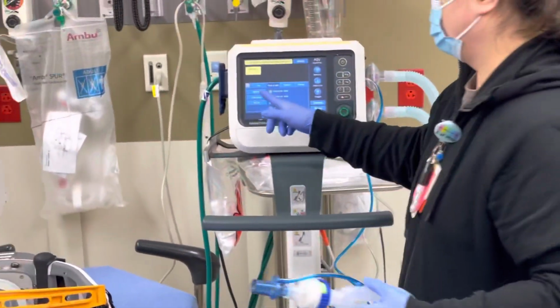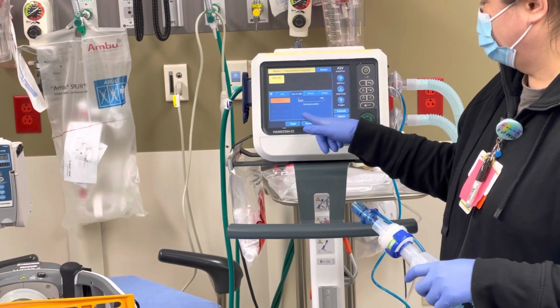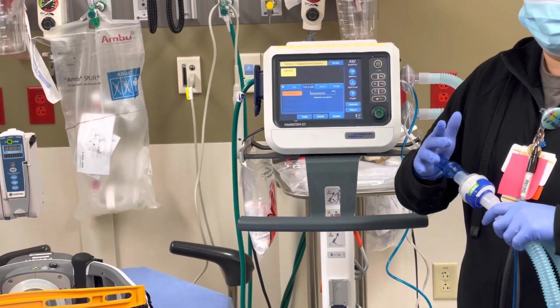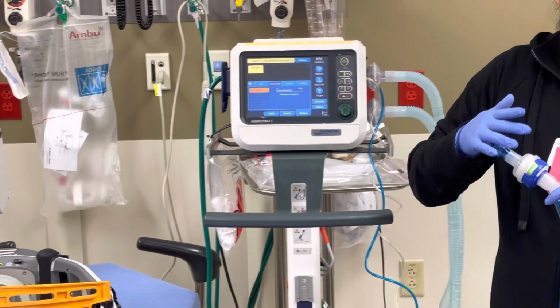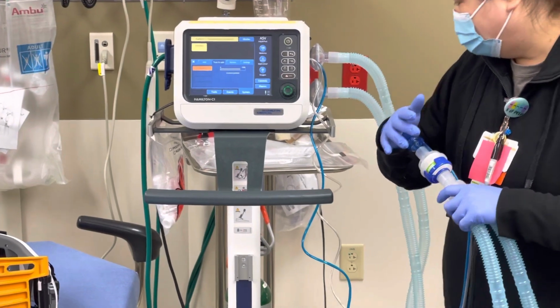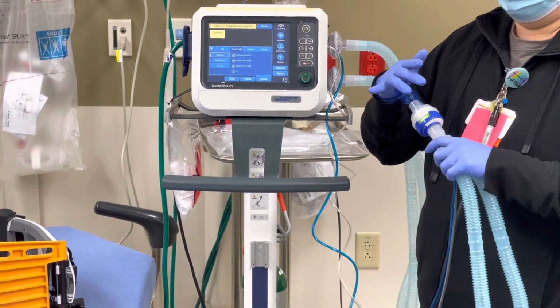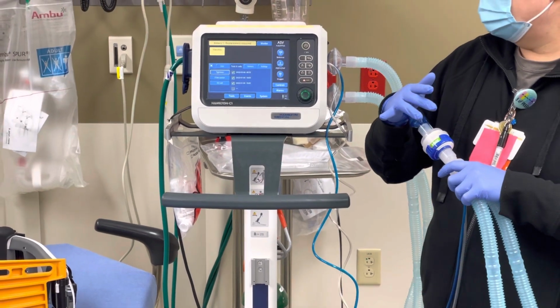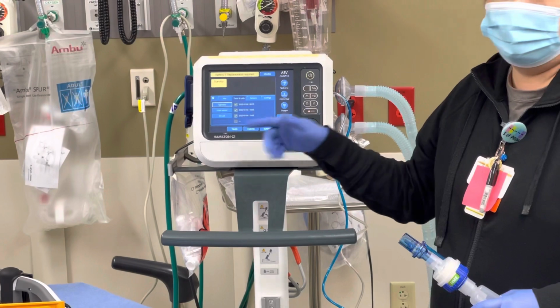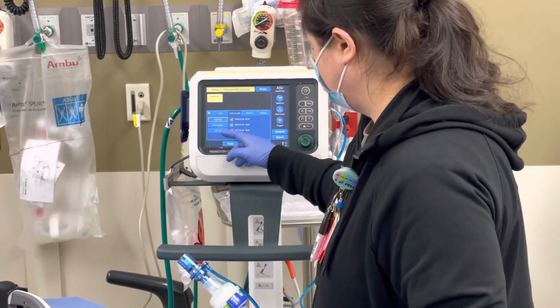So the first thing you're gonna do is you're gonna check your tightness. So you're gonna click your tightness, and you're just gonna follow the directions. It says disconnect patient, and it's gonna say tighten your patient system. So normally there's a cap that will come with these in the package. It has like a little red end to it. You can use that. I didn't see it. It'll say connect your patient, just keep letting it go. And there you go. As long as you got your green check and today's date and time, then you're good. That means you passed it. So next you're gonna go to your flow sensor.